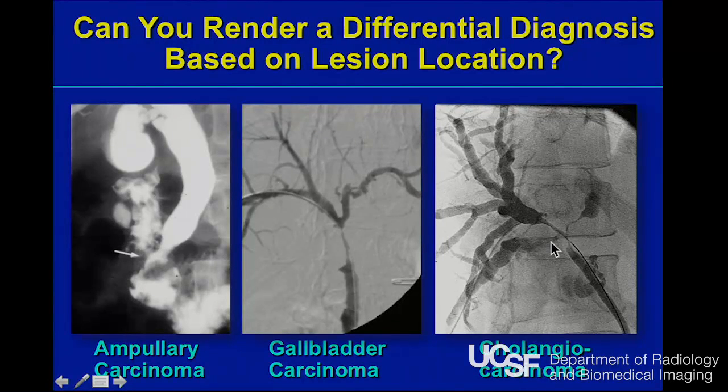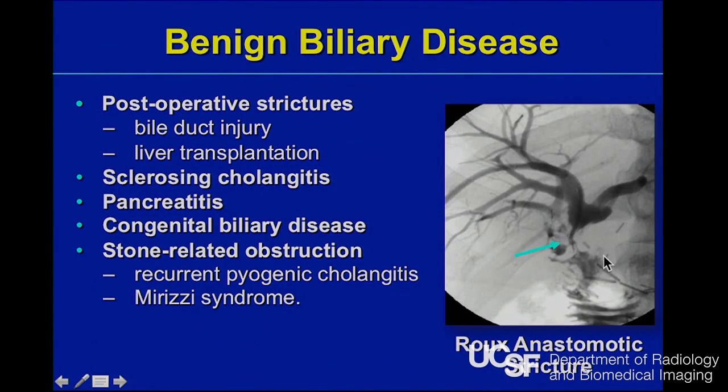And this is a typical Klatskin tumor appearance where you have basically pinching off of multiple segmental ducts and left lobar ducts. So you see all 3 ducts are actually pinched off, and there is a stricture involving the common hepatic duct. And here this is an example of cholangiocarcinoma, but there could be mimicking lesions for this appearance. For instance, metastases, particularly from colon cancer, HCC can give this appearance as well, but this is a classic cholangiocarcinoma Klatskin appearance.